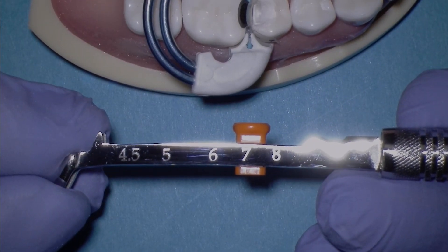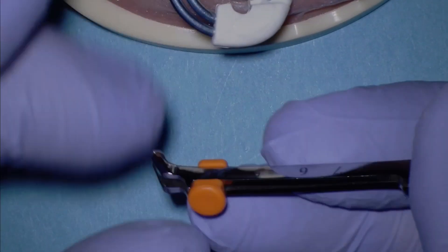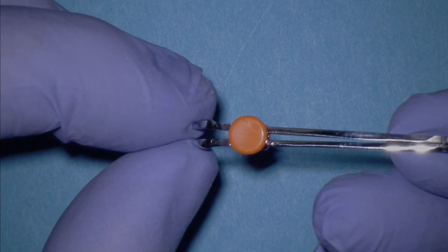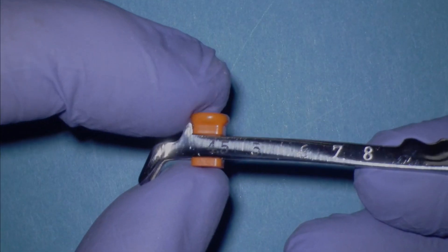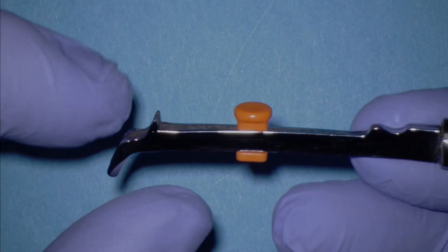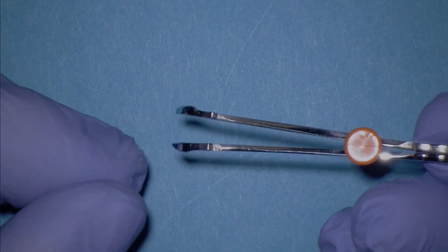I'm going to set the slider button back to the smallest position at 4.5. This would be appropriate for the premolar or black evolved matrix. For most molars, using the blue evolved matrix, use the setting at 5 to 6. For wide molars, using the orange evolved matrix, use the setting at 7 to 8.